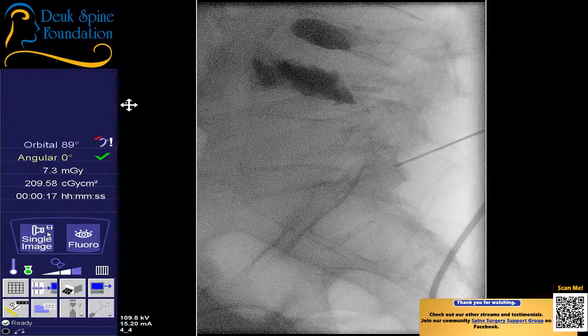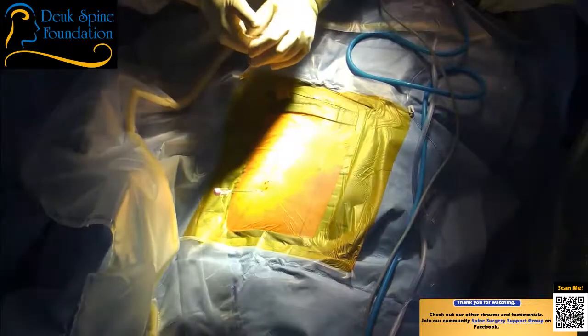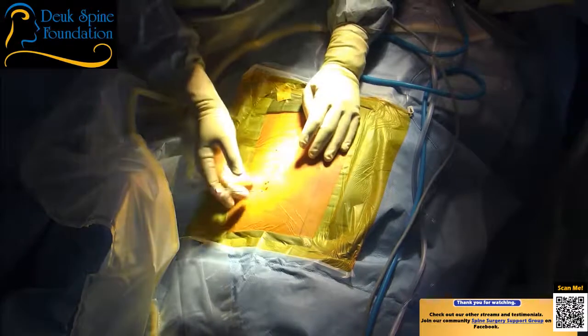Yeah, I know that's a little uncomfortable. I apologize. Shot. Unfortunately, we're a little limited in how much we can put you to sleep during this because of your COPD. Shot. So we don't want to overdo it.